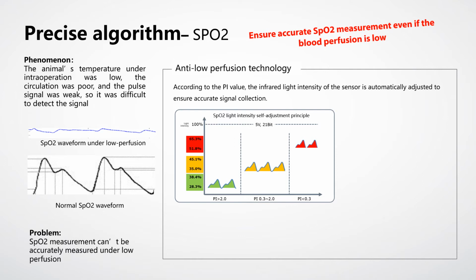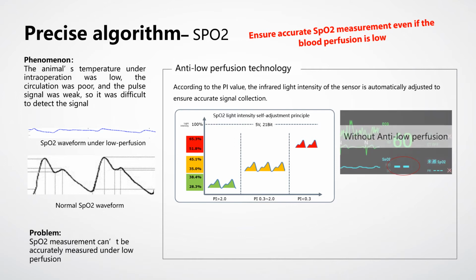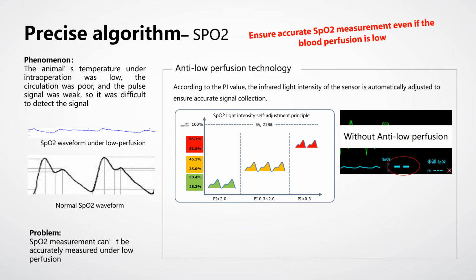So according to the PI value, this is the perfusion index value, the infrared light intensity of the sensor is automatically adjusted to ensure the accurate signal collection. Which means when the perfusion index is lower than a certain level, normally lower than 0.3, then the system will just adjust the lights to make better measurements.